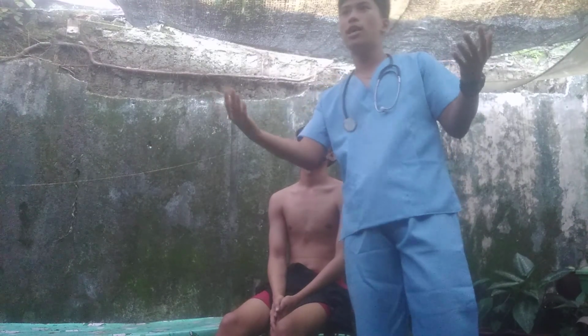We are in a private space in our house, so I have provided the privacy to avoid embarrassment to the patient. Expose the axillary region. Pakitaas po ng kamay. As you can see, this is the axillary region. And now I will prepare the thermometer.